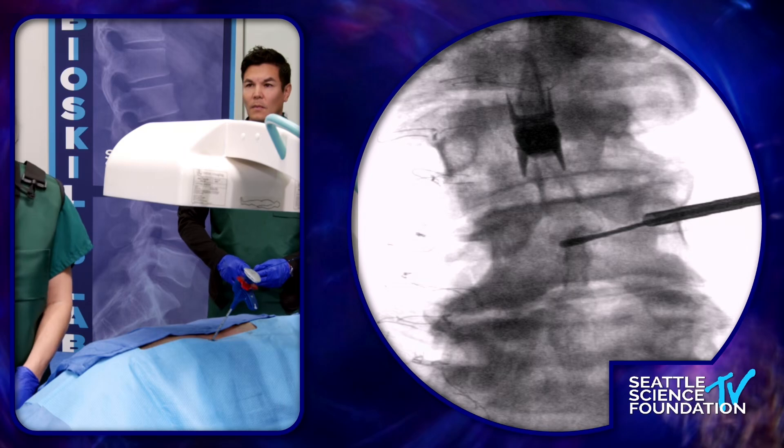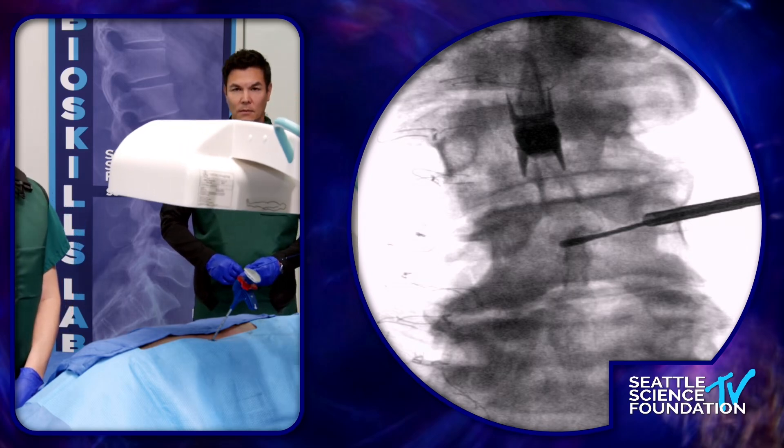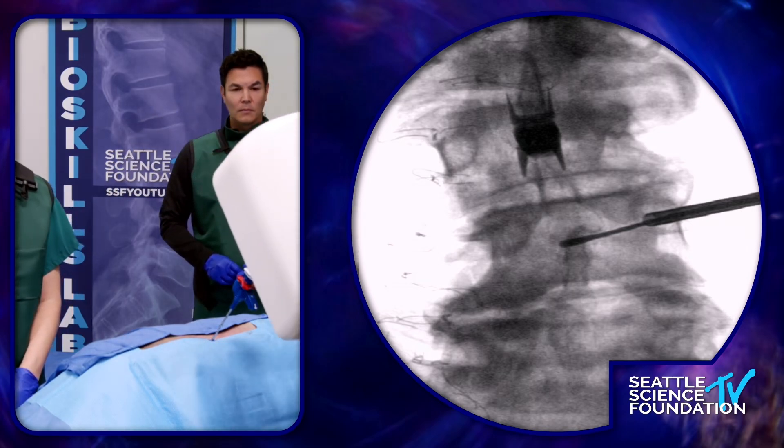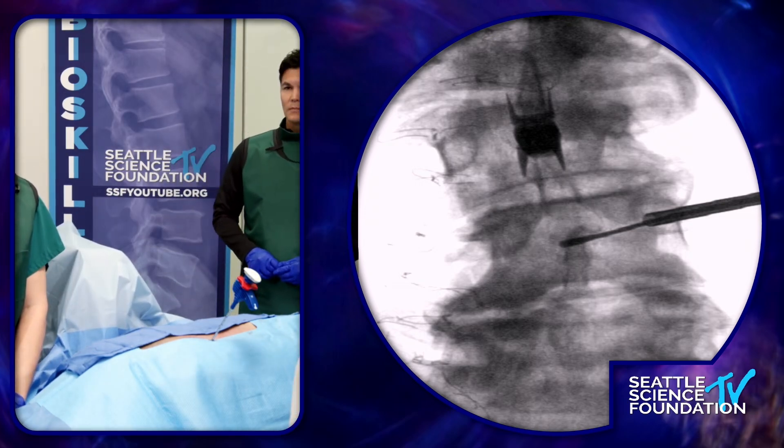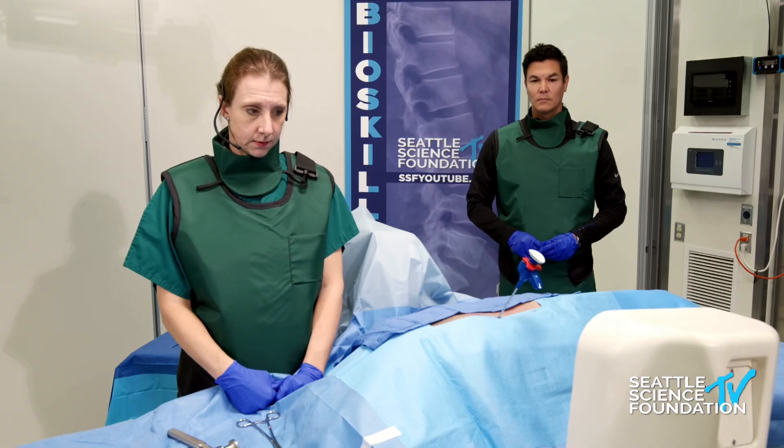Could you go back to lateral and maybe raise the table an inch so that the fellows can see the entire vertebral body and have a sense of confidence that they know where the 50 percent mark is? Because in the AP, you are in the bullseye.